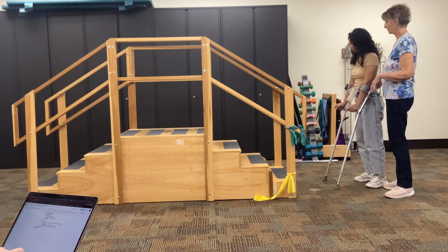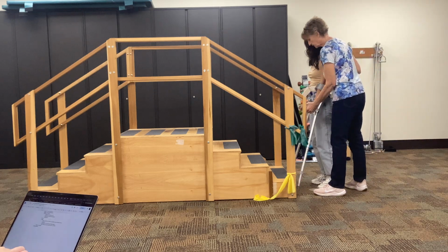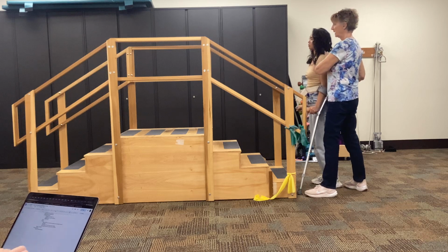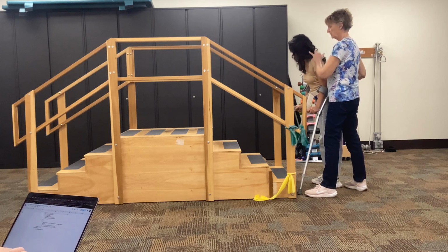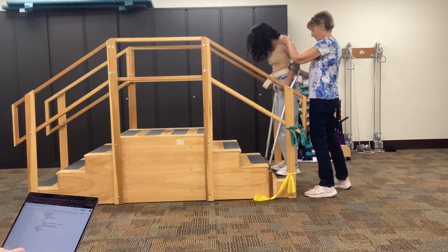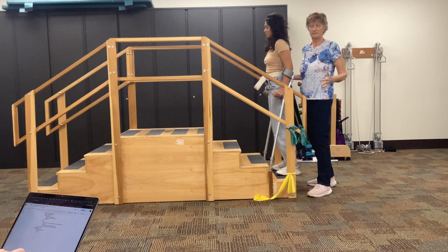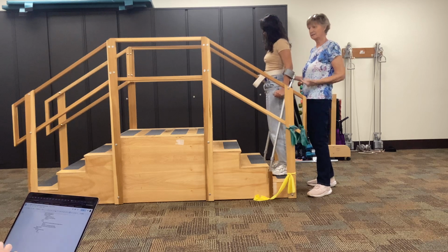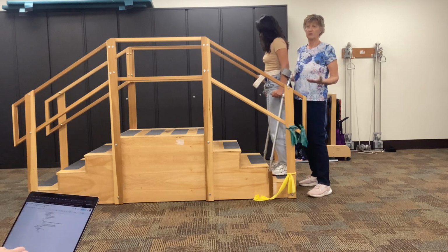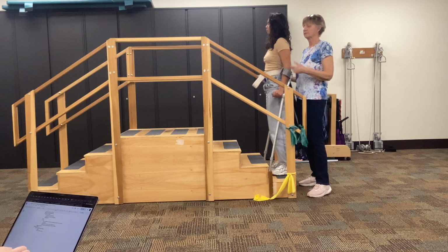So just come on up to the stairs. Okay, keep those apart so you don't get your feet on them. All right, so she's going to bend, push on the crutches, and hike her whole body up to that. Bring the crutches up, see her back. Okay, and she's bending her knees. Okay, unless I stick 2x4s strapped to your legs, it's very hard not to. Okay, come on, but just walk down.